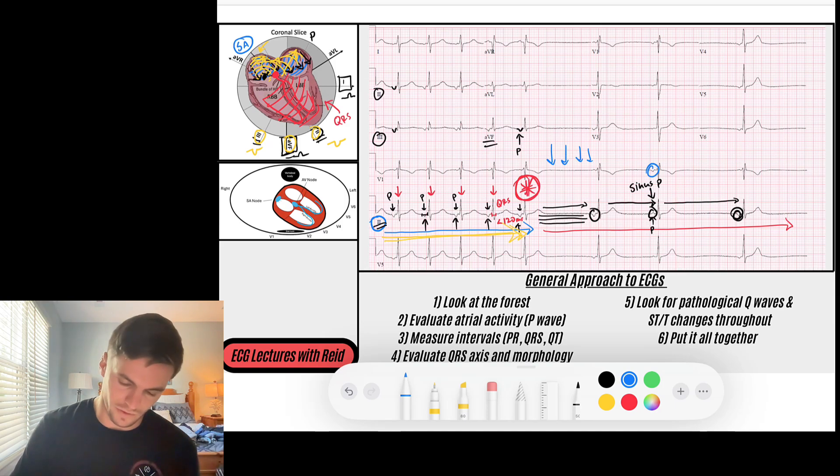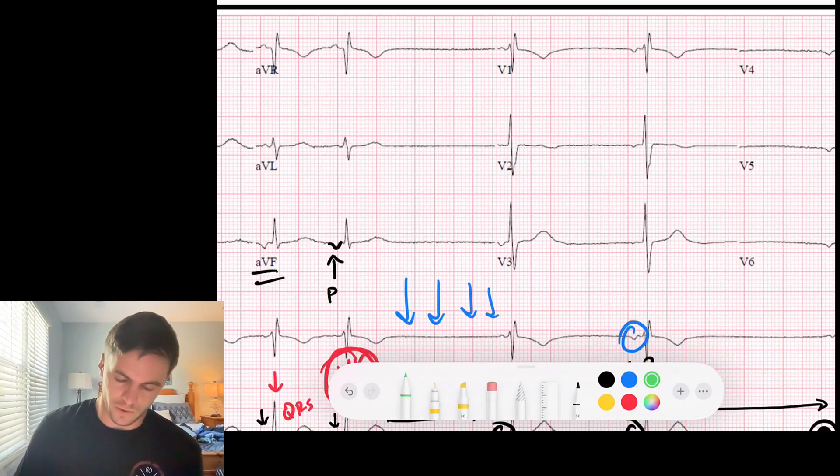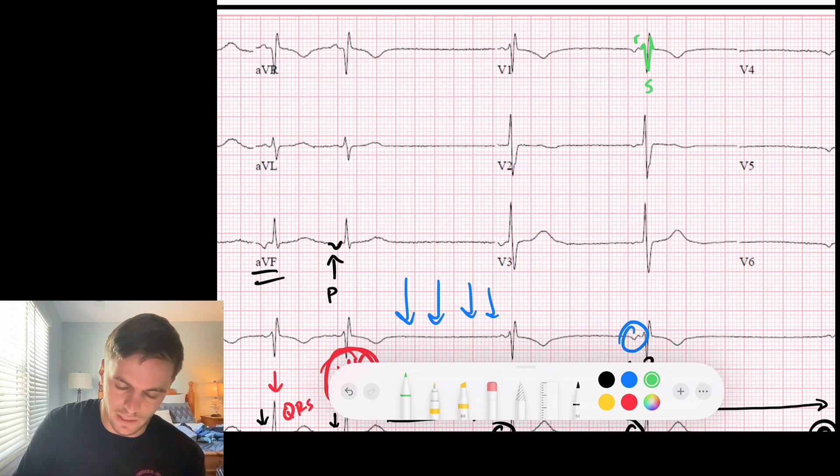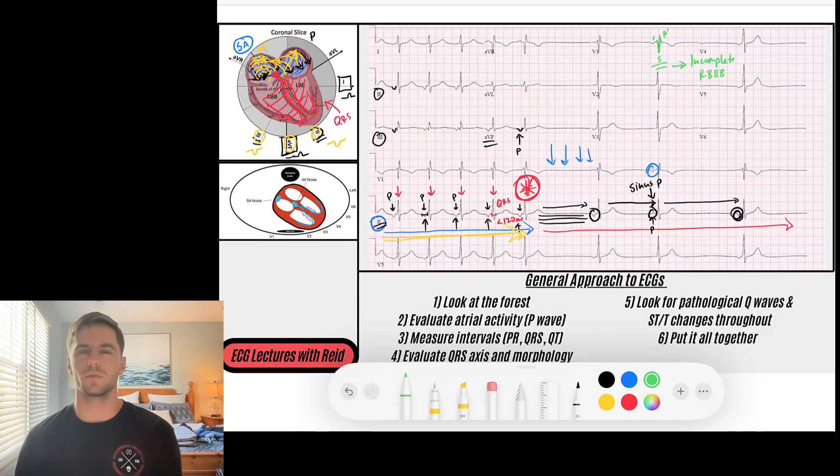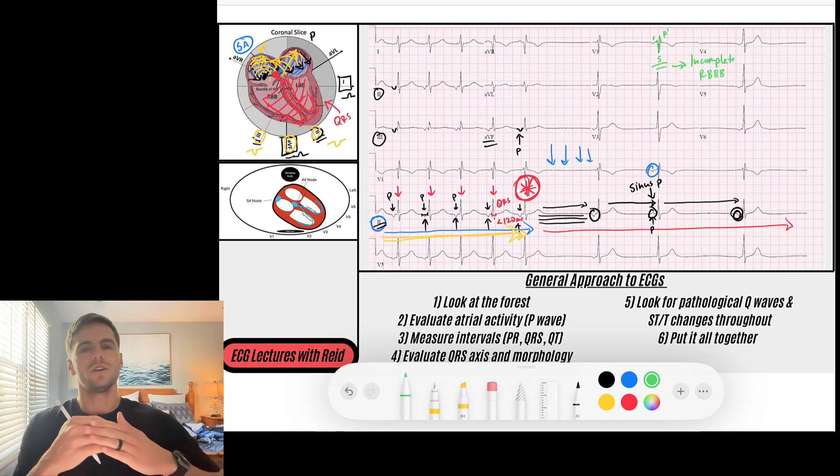So then we see we get conduction through the QRS complex. So we have to take a look at the morphology of the QRS complex. You see we've got a little bit here—this is outside the realm of this discussion, but you see we have a little RSR prime. We have a little RSR prime lead V1—that's a right bundle branch morphology. However, it's a narrow complex QRS, so that's actually going to be an incomplete right bundle branch block in the setting of an ectopic atrial rhythm.